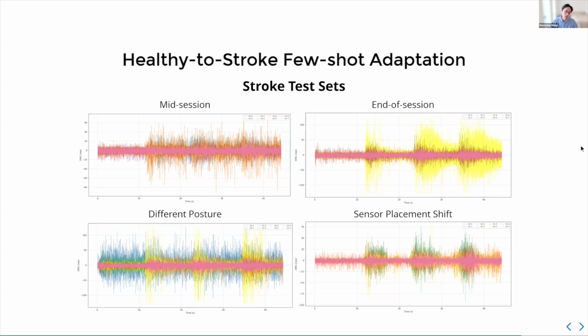You really have to be accurate when the person is moving their arms, at different postures, trying to use the device, and when the sensor is not placed in the same position. Which happens because you take off the sensor one day, you put it on tomorrow, it's almost never the same position. So we're trying to see if the generalizability is usable, useful in the out-of-distribution settings in our case.